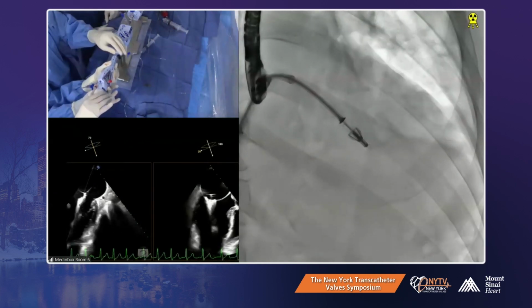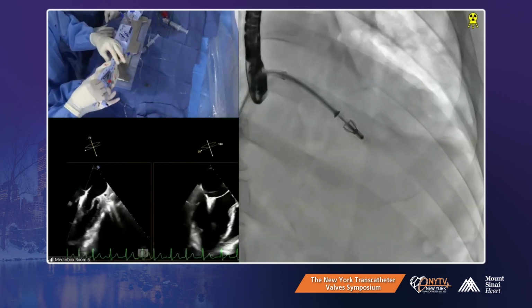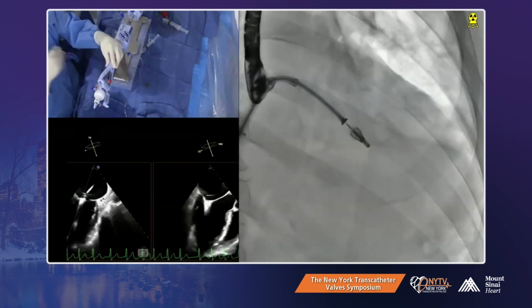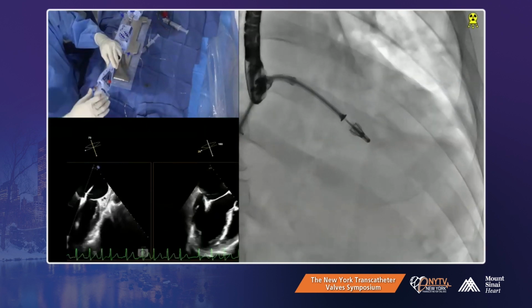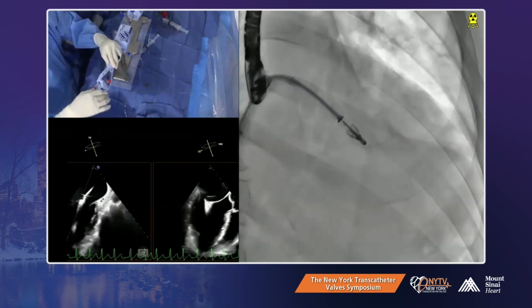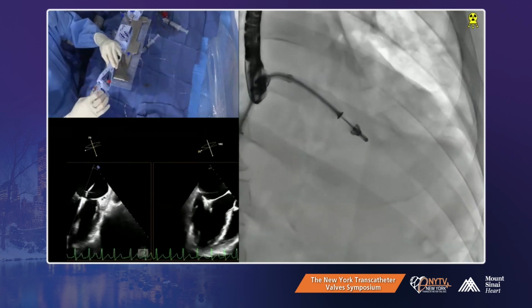No, we're losing it as we close. Still losing it? Interesting. Yeah. Want to give back to posterior? No, don't look. You lost it again. We're losing it as we close. It's interesting, right? You saw that? Everyone saw that, right? Unless we tore it. No. Okay, show us, please.